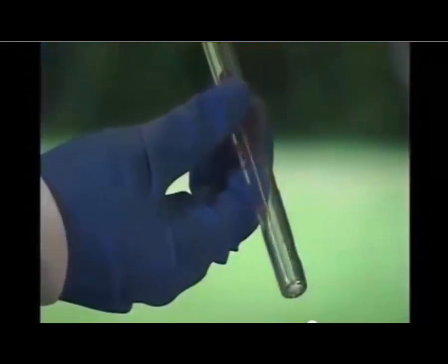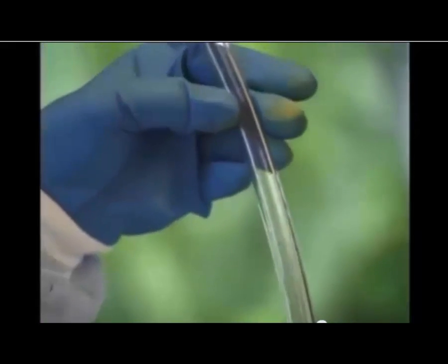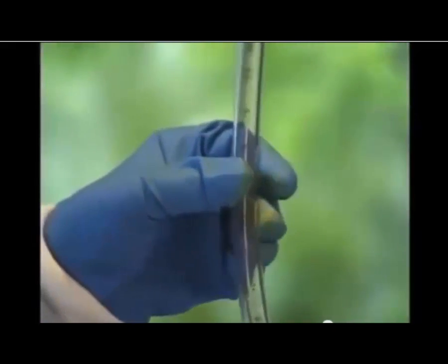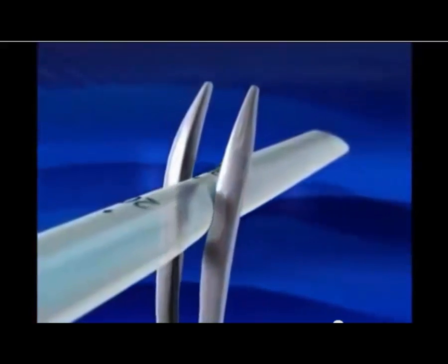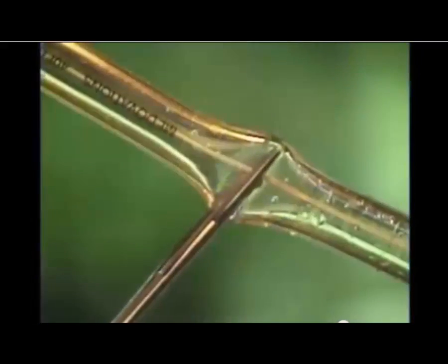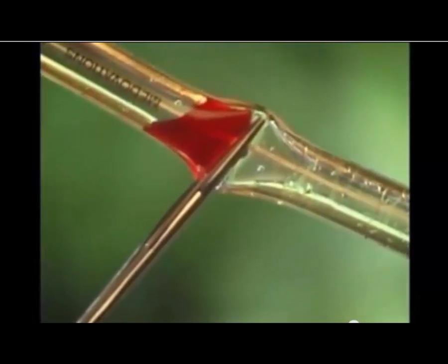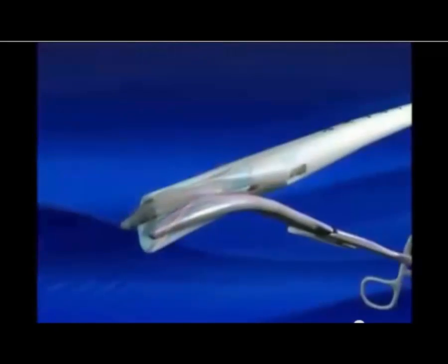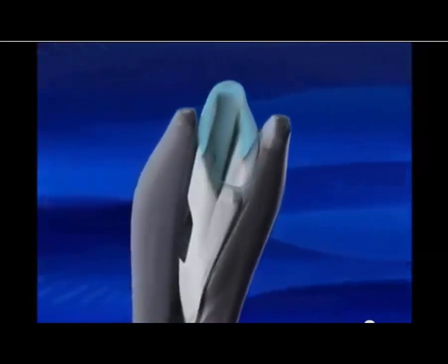A large chest tube, a number 36 or number 40 French, is used in trauma to allow for the evacuation of blood and clots. Clamp the proximal and distal ends of the tube before insertion. The distal clamp will keep any blood from rushing out before it can be connected to a collection chamber. The proximal clamp will assist in chest tube insertion, but may not always be necessary or helpful.